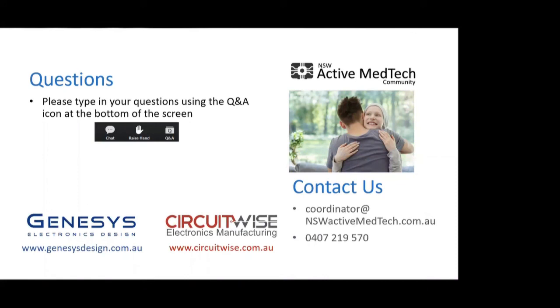Yeah, Matt, hi again. The answer to that is we took a technology called a micro lens array, which we've worked with in the telecom space. It's like a plain sheet of glass with a whole series of very small lenses imprinted upon it, and you can imprint whatever pattern of lenses you want. By illuminating that with a single broad beam, you generate as many output spots as there are micro lenses. That's how we do it. That's in the public domain, it's patented, and it's one of our really key optical developments: pulling these component concepts out of the telecom space into the medical space.